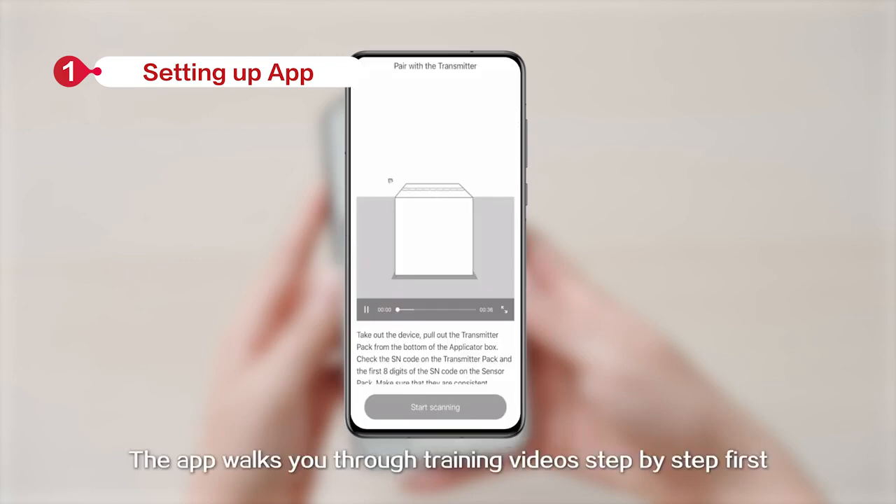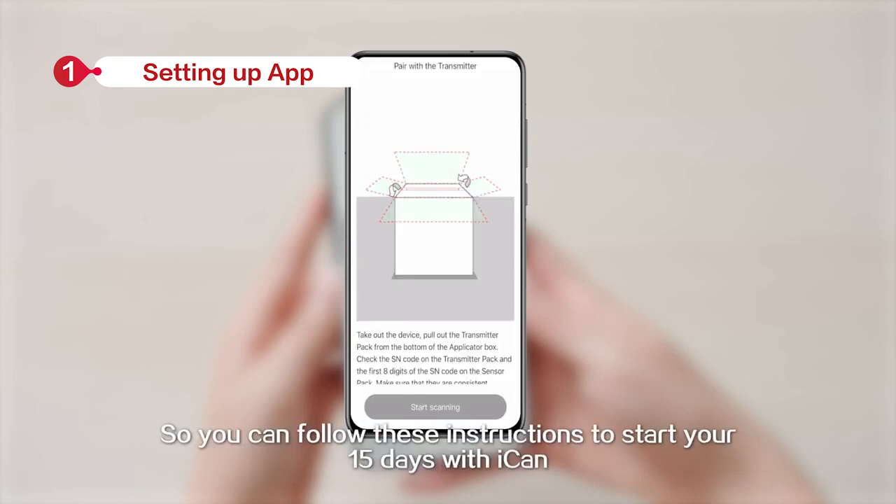Once logged in, the app walks you through training videos step by step first, so you can follow these instructions to start your 15 days with ICANN.